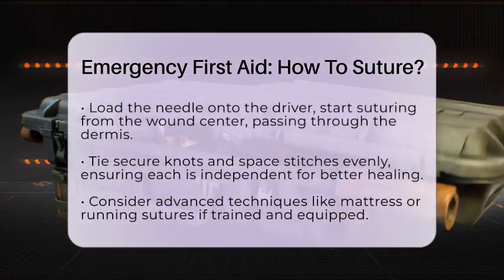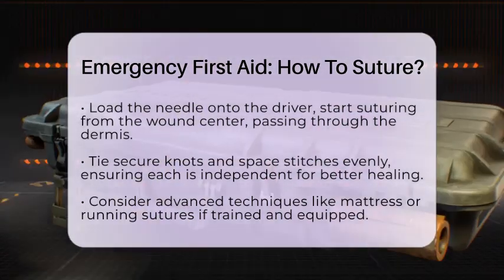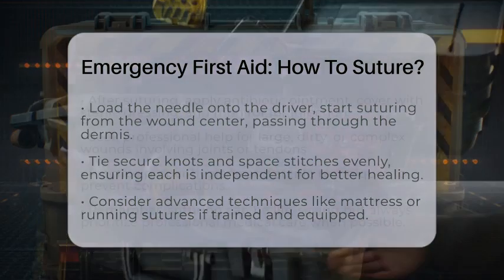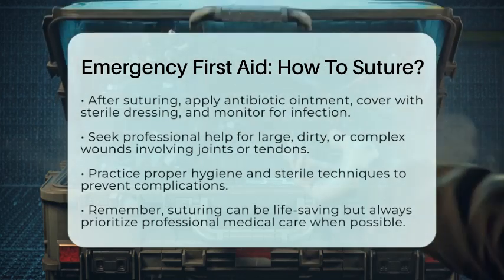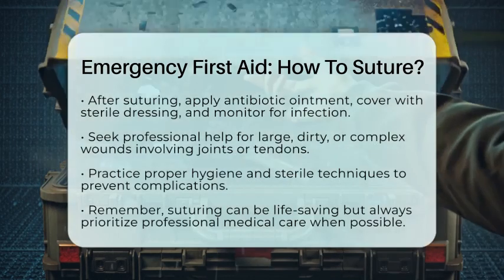If you're trained and equipped, you can try advanced techniques like mattress sutures, which are useful for wounds under tension, or running sutures for faster closure. Buried sutures can be placed in deeper layers for stronger closure and better cosmetic results.